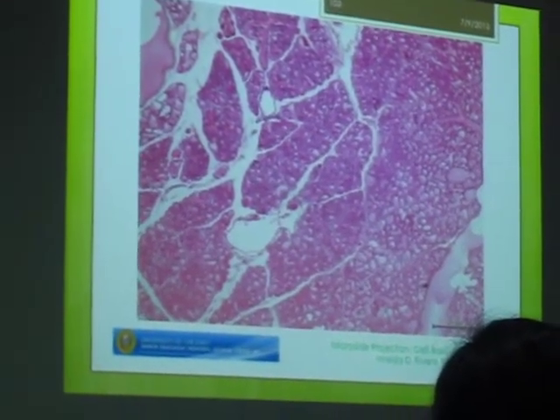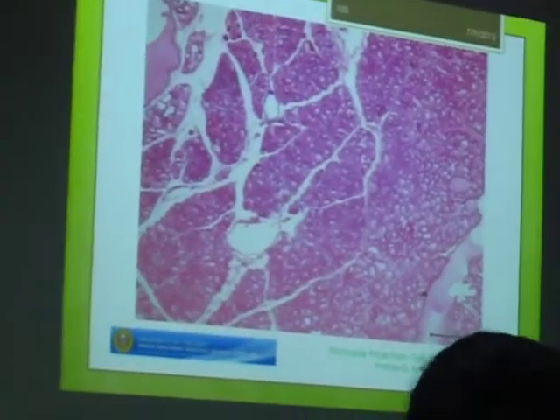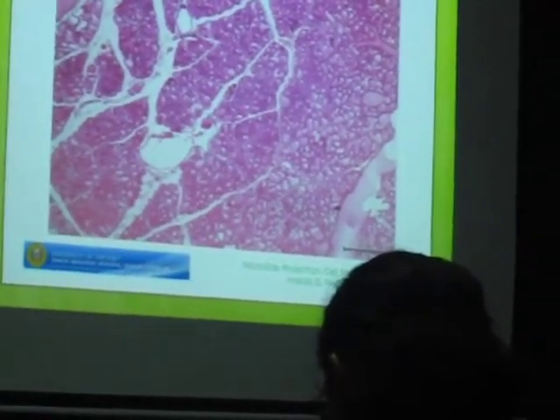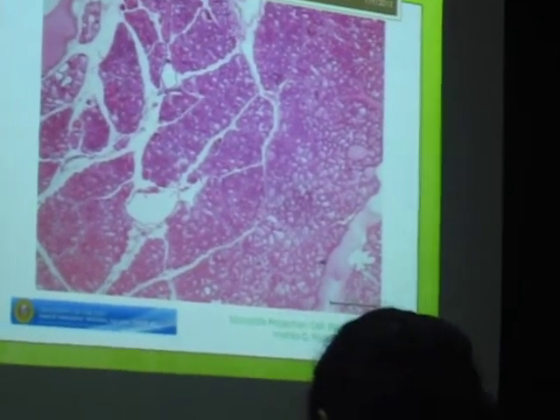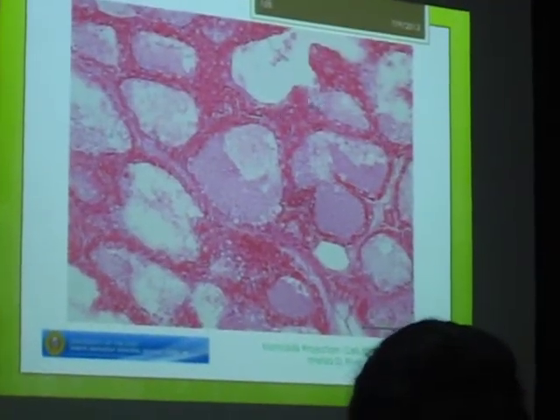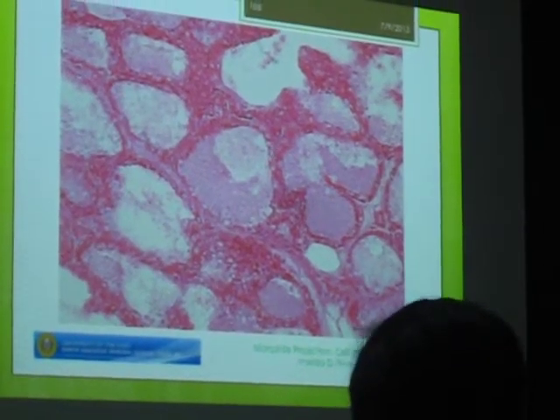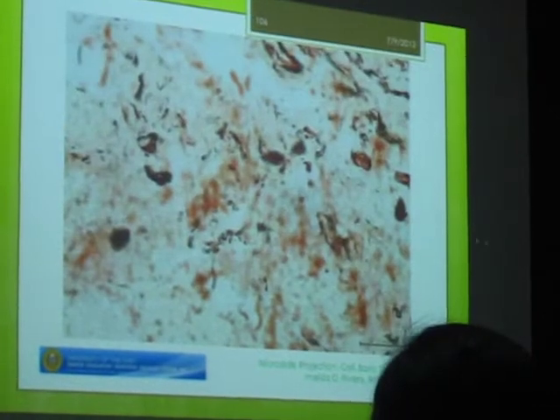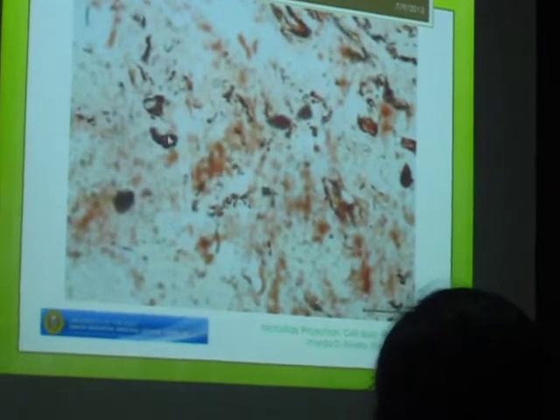What type of gland is your mammary gland according to gland cell participation? Apocrine. So when it's an apocrine gland, the apical portion of the cell is secreted together with the product. It's better if you look at the demo slides in the histolab.